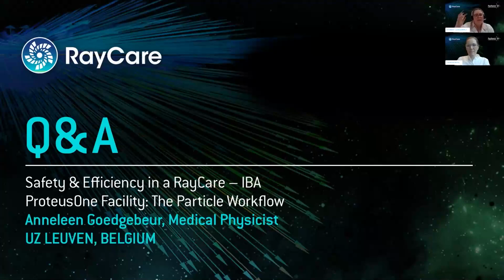Then when closing down RayCare on the treatment side, it automatically asks, do you want a continuation session? We keep that ticked, of course, and then we can reschedule that continuation session. So in my opinion, that goes quite smooth. The only downside is if it hasn't happened in a while, then I always need to think, okay, how do I need to schedule it? But generally that goes quite smooth.